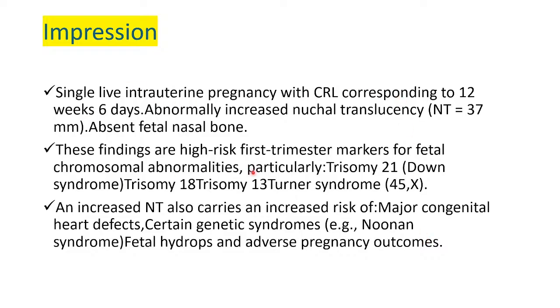So this is just the detailed notes. I'm just giving you this information so that you have an imprint of what we are talking about, or the risk of an increased NT on ultrasound. So the major thing that you're supposed to do is to report on the abnormal NT and also comment on the nasal bone. Also, you have to talk about the ductus venosus if you have examined it, or if we are lucky to see it nicely.